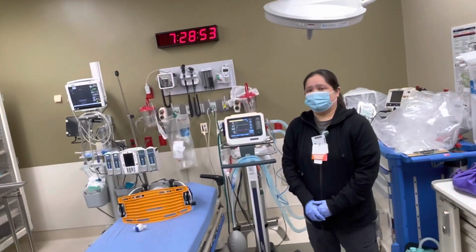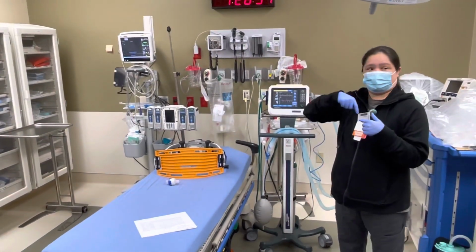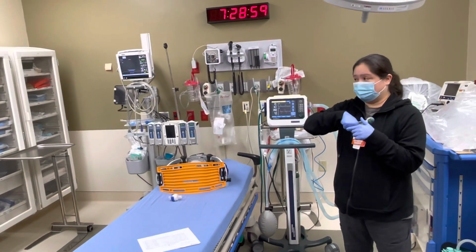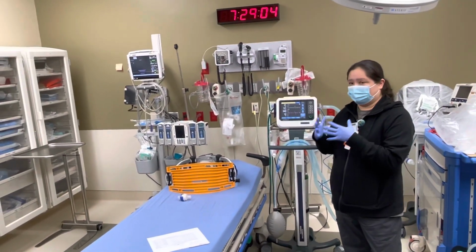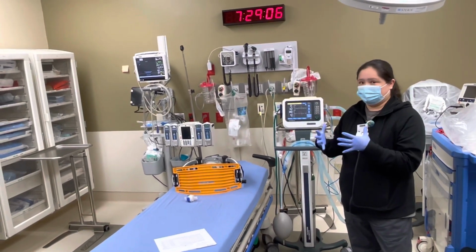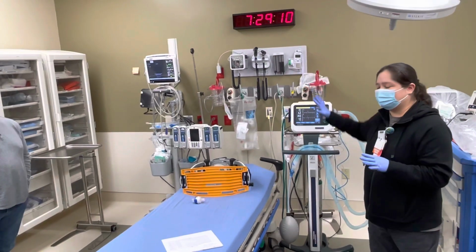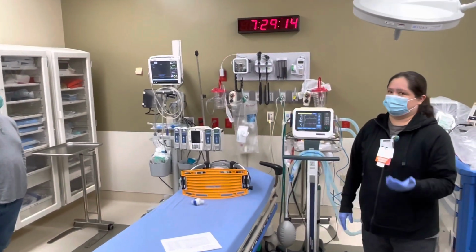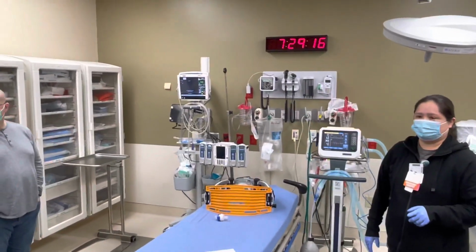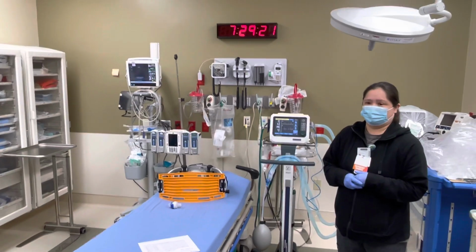Everything stopped. That will happen a lot of times, if the tube is right mainstemmed, meaning it's too far down. Your x-rays are really important too, because all that volume is going to just one side and not the other. If everything looks perfect, the patient looks perfect, and you can't figure it out, I'd always get an x-ray, because most likely the tube is too far down into the lungs and just needs to be pulled back.